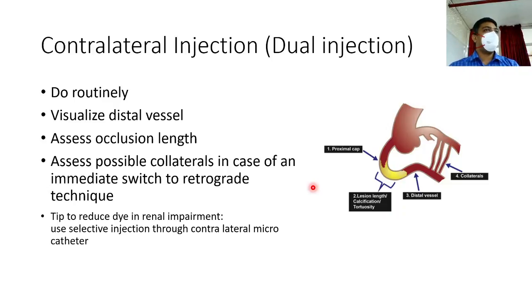Access, I'm coming. We may need more access. Even triple access will be required. അത് 300 ഉം 320 അത് വരുന്നുണ്ട് സർ. ACT, what is the thing? ACT value ആണ്.